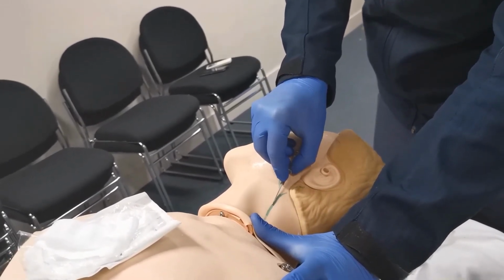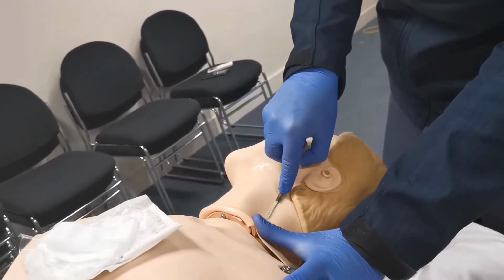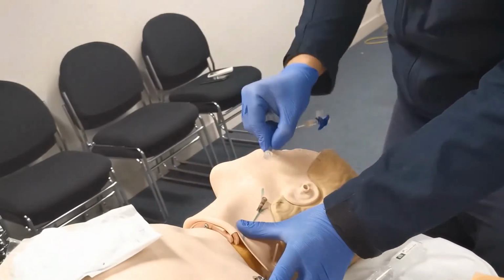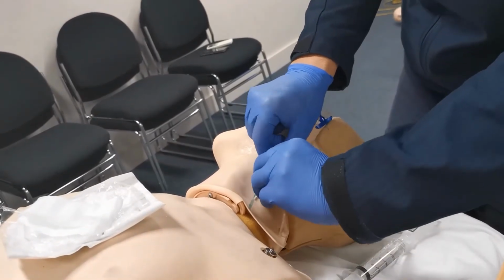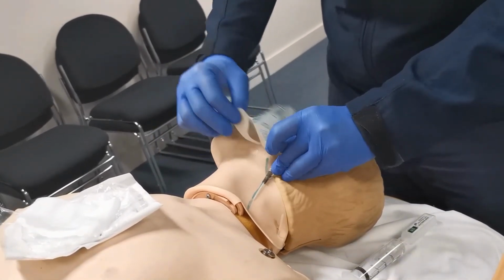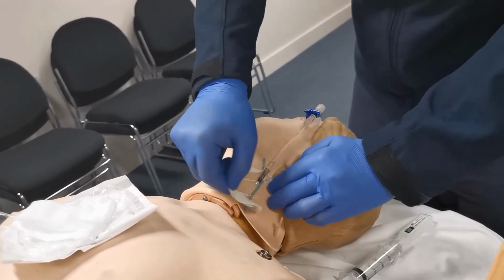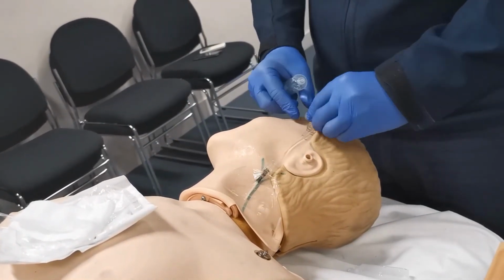Once you get flashback into the chamber, advance both the cannula and the needle further and occlude your cannula. Immediately dispose of your sharps in your sharps container and attach your pre-primed J-loop and 3-way extension. Apply your aseptic Tegaderm to the hub. And confirm patency with a large 20mL flush.